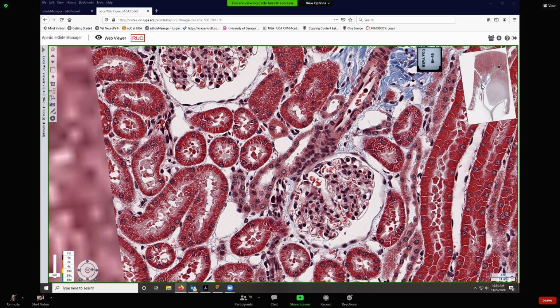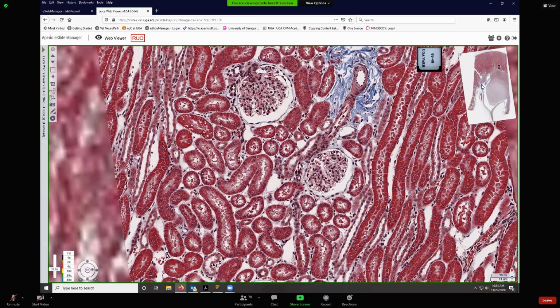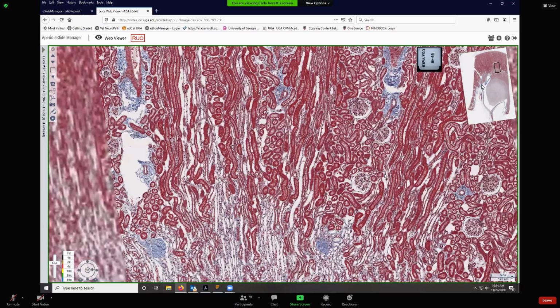We ask you about mesangial cells. And then we ask you about the interlobular artery. We've already covered the mesangial cells, so I'll move on to the interlobular artery. So this is a question testing your knowledge of blood flow in the kidney.